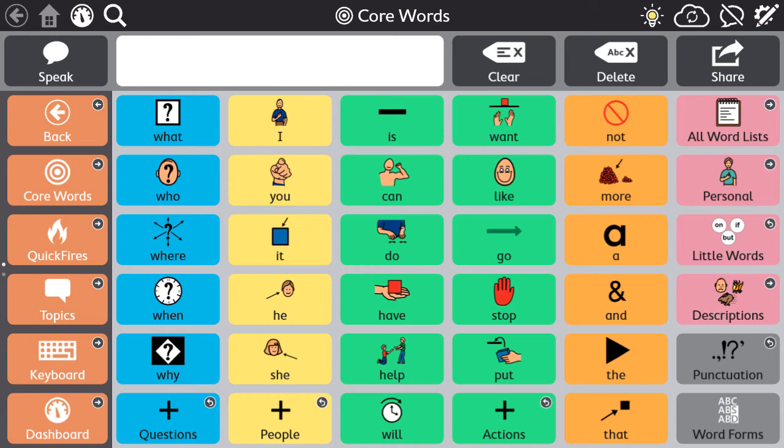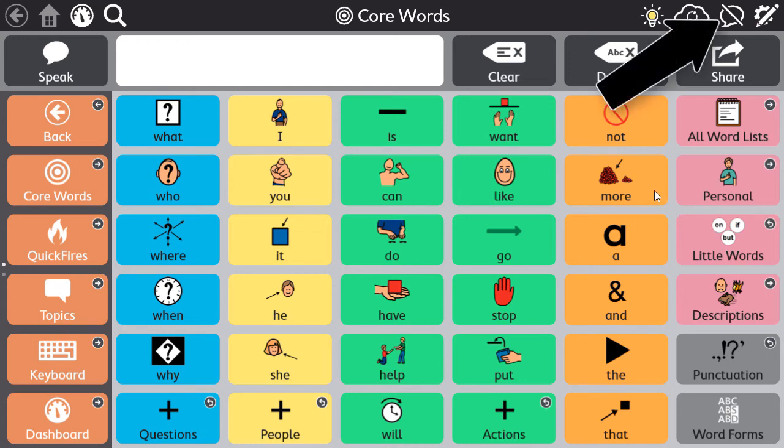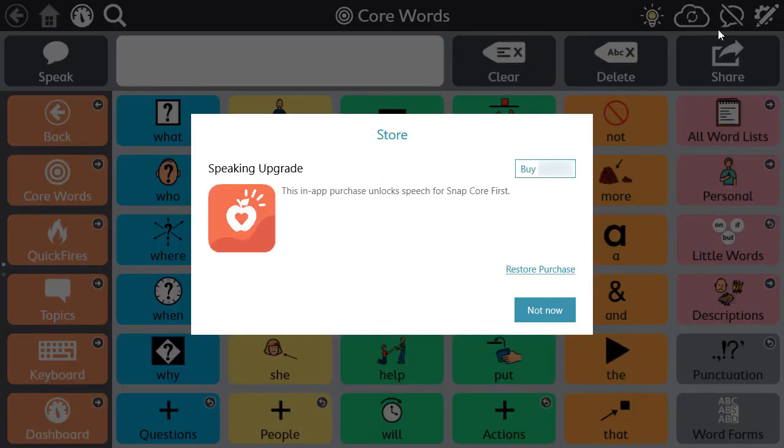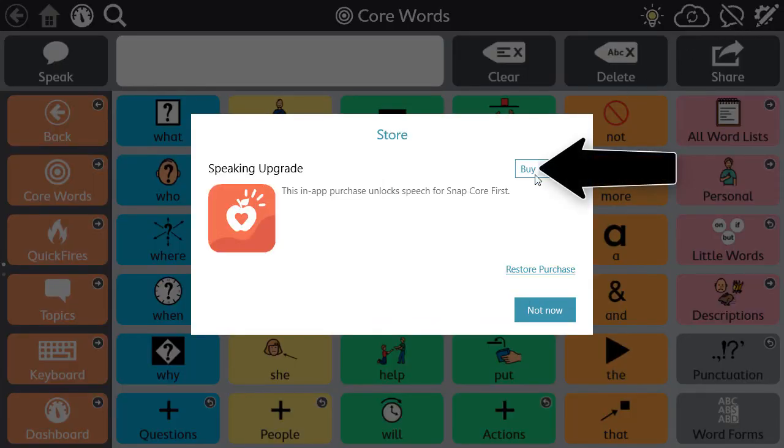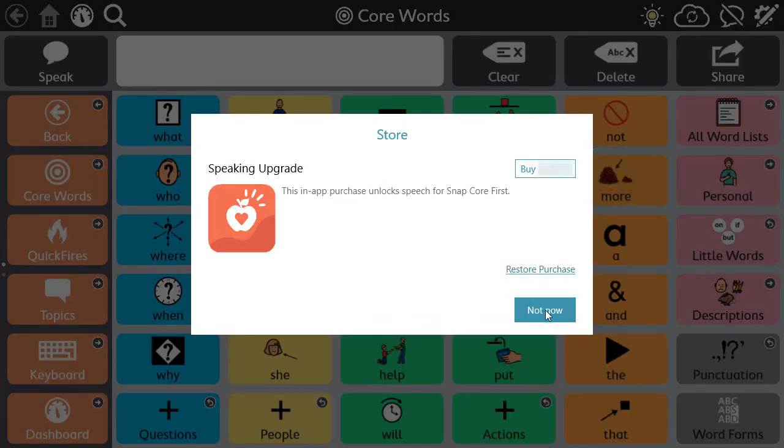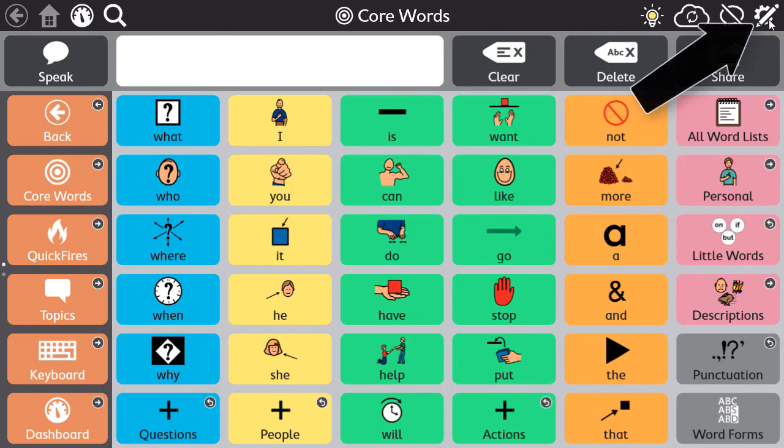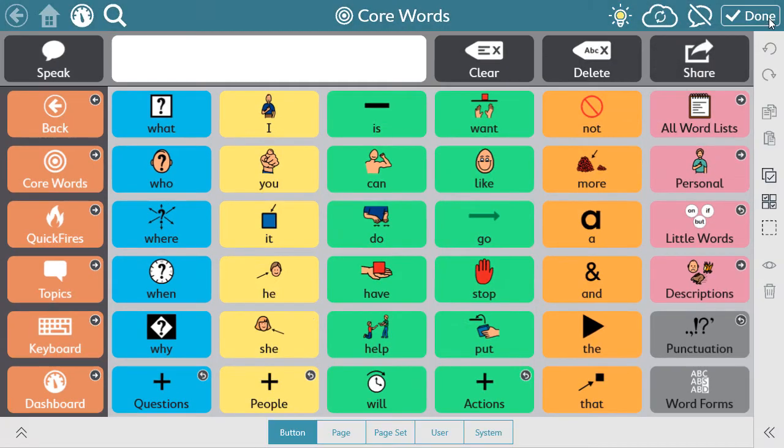You can complete this purchase by selecting the speech bubble, selecting buy, and completing the purchase process, or you can access the store through the edit menu.